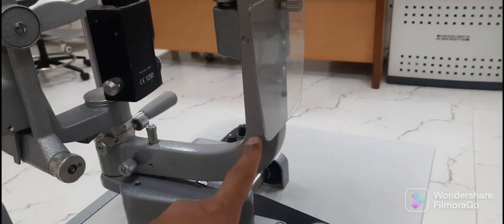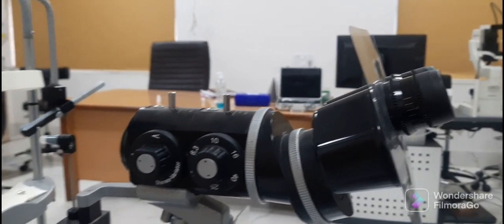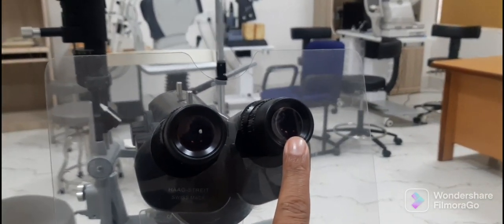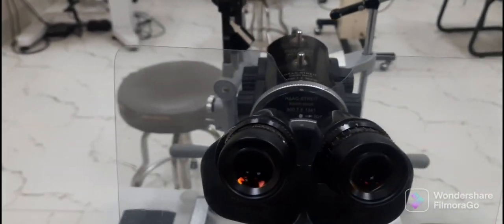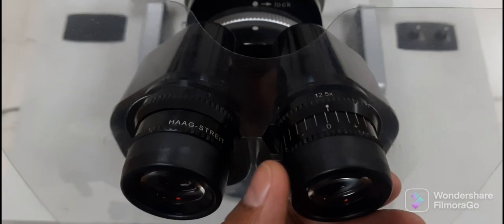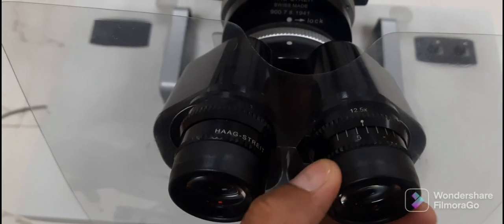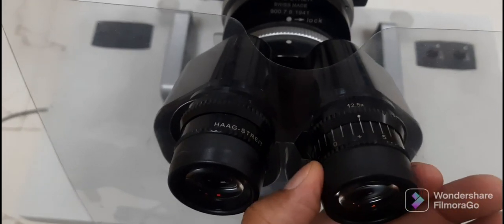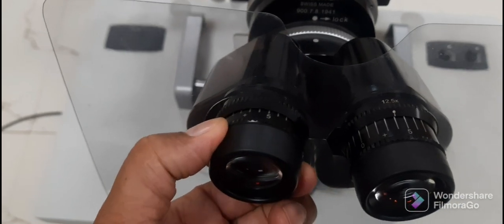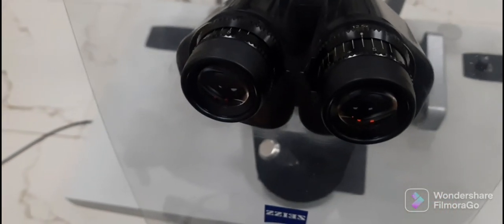This is the observation arm, through which the examiner examines the patient's eye. It has two eyepieces, right and left, each with a scale above it used to adjust the eyepiece according to the refractive error of the examiner by rotating the knob. If the examiner is emmetropic, it is adjusted to the zero scale for the best view. After adjusting the knobs, the IPD is adjusted.